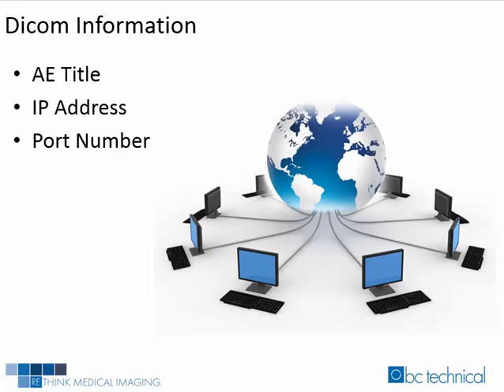Every piece of medical equipment that is Dicom compatible has its own name, address, and zip code. The name of a medical device is called the AET or AE title. It stands for Application Entity Title that is unique, so no other medical device can use that name in the same network.